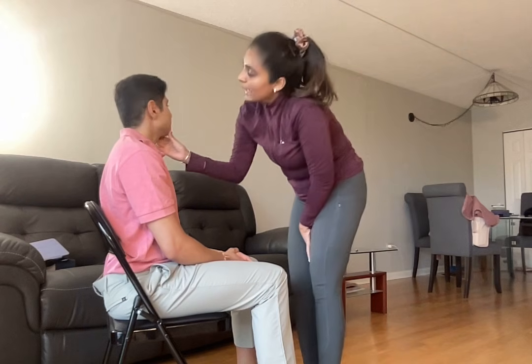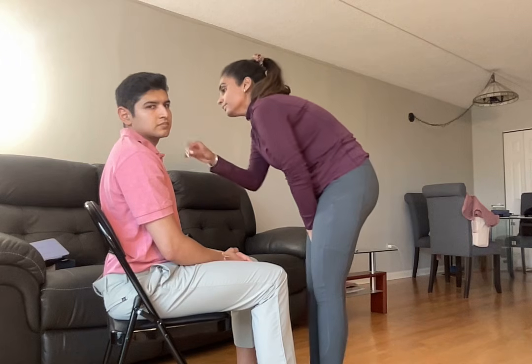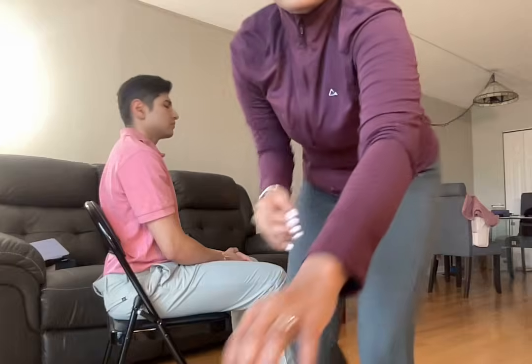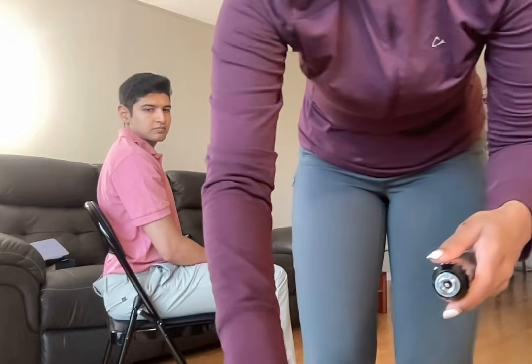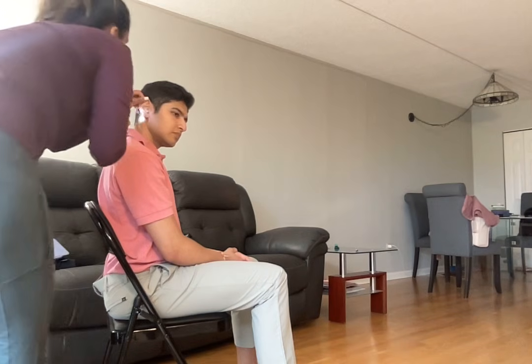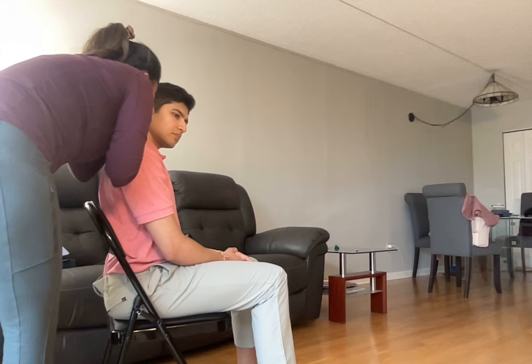Okay, and now we are going to check your ears. I am looking for symmetry, and there's no deformity on each side. And now we are going to use our otoscope. I'm also looking at the auricles along with the surrounding tissue. Everything looks intact.